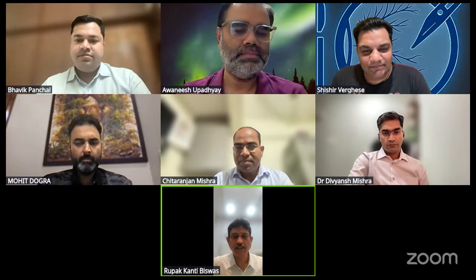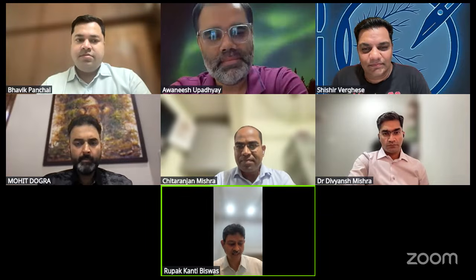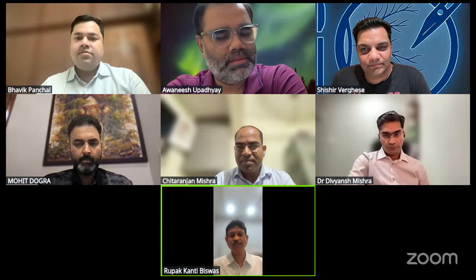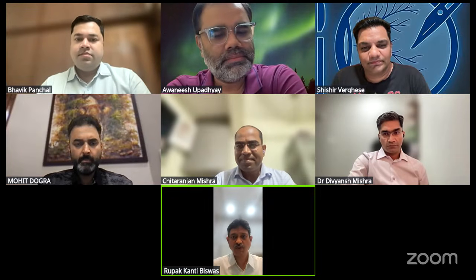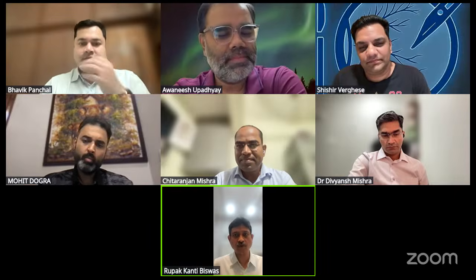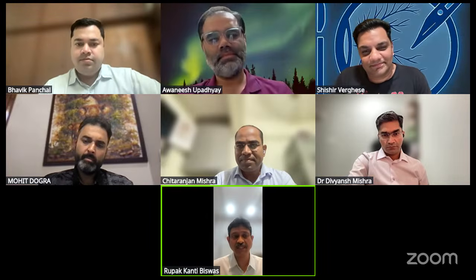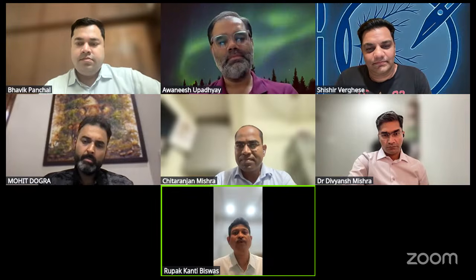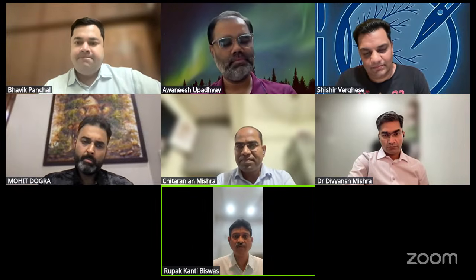Bhavik, when there is no specific technique, there are multiple techniques, so we need to accept that. All the techniques can close the hole. Now the most important question is: are we looking for only the hole closure, or are we looking for the functional ability of that area?